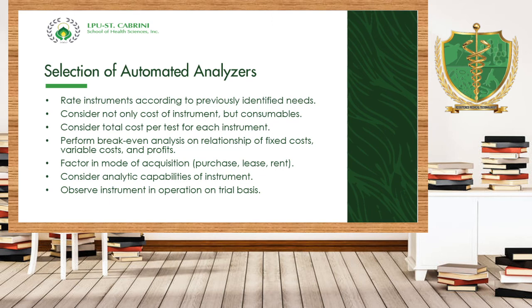Ay consider total cost per test of each instrument. Kaya yung mga laboratory, nagagawa sila ng cost analysis or cost accounting. Ganito kalaki yung test, ganito kalaki yung machine, ganito kamahal yung machine na binili natin. How much yung pababayad natin per test? Kasama po yun. No? Kaya pag kayo ay naging chief medical technologist na or naging medical technologist or section head, you have to consider also which machine you will recommend.